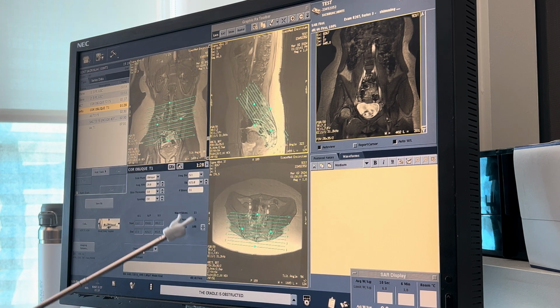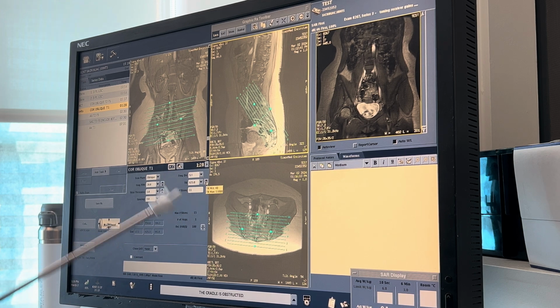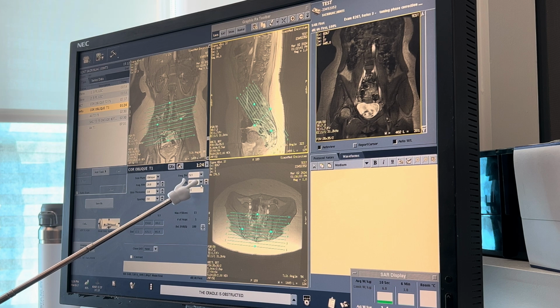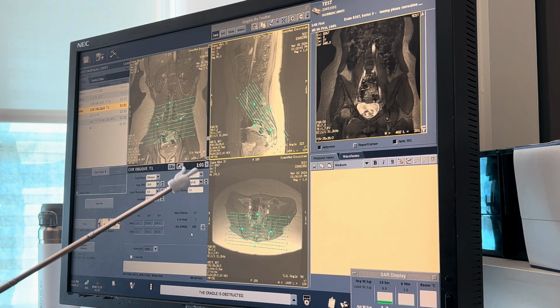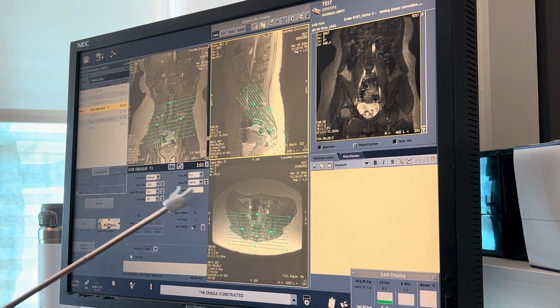Let's optimize our TR. 1 times 15. We only need 11 slices worth, not 15. So if we want to go from 15 to 11, what should we do? Down. Yeah, you should decrease it, okay? But one other thing, just as a shortcut, now that you understand what's happening here, click this, and you could just click on one acquisition. Perfect. We have 1 times 11 equals perfect 11. 1 minute is solid, and T1 range is 350 to 750, so our TR is within that range. This looks good. So let's save that.